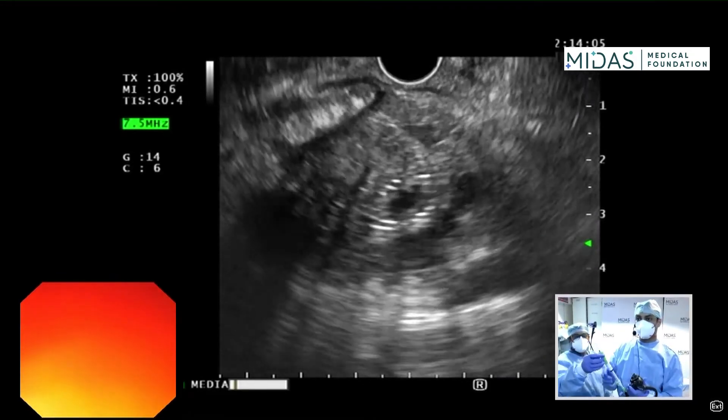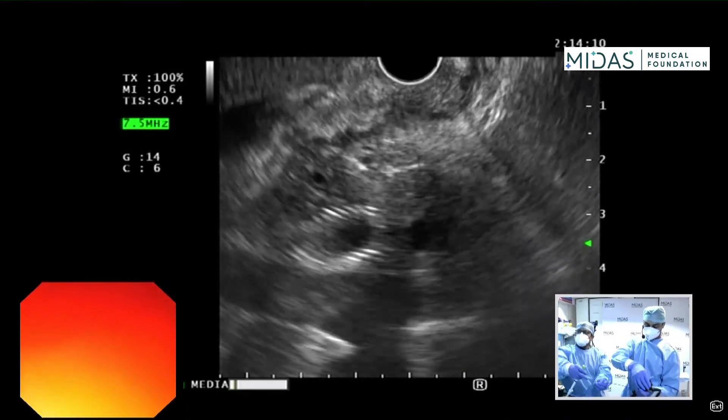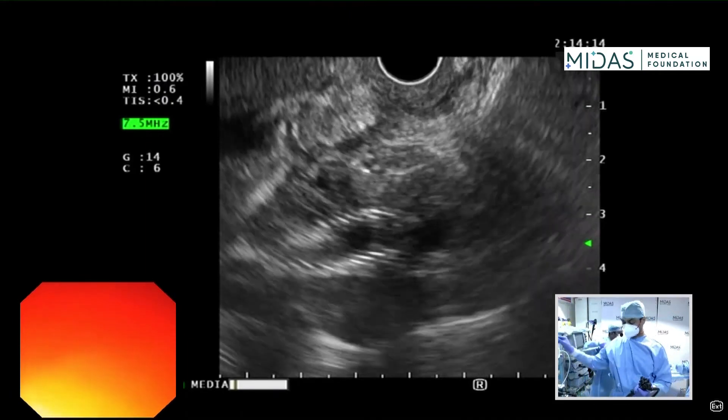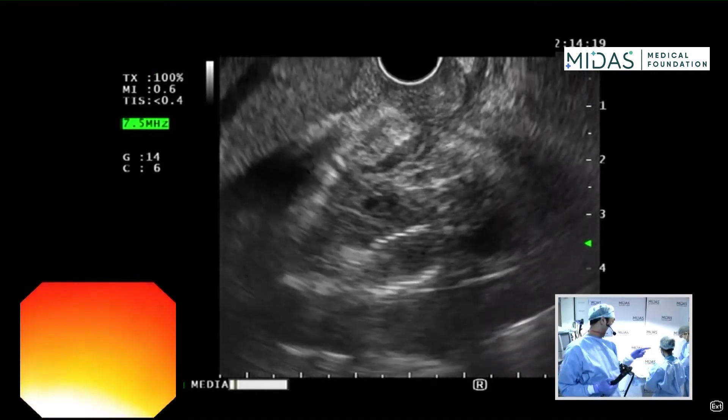I'm going to pull it back now. We're going to unscrew. Now you can zoom the camera in on this as the assistant expresses the sample.